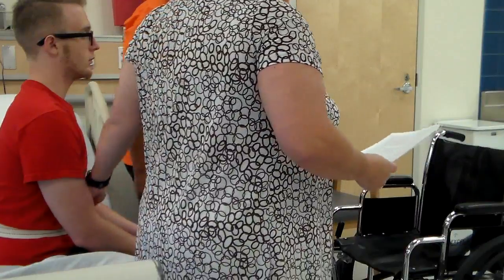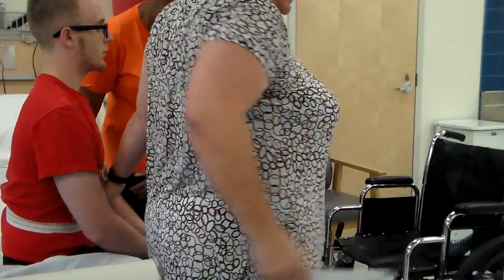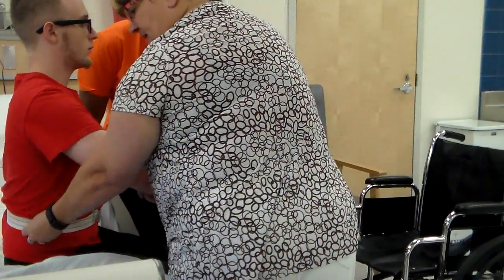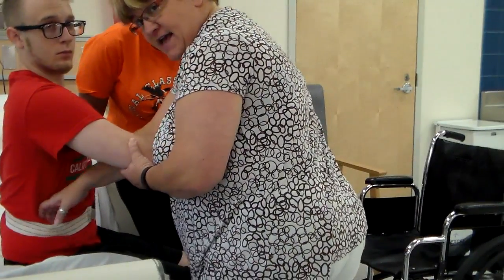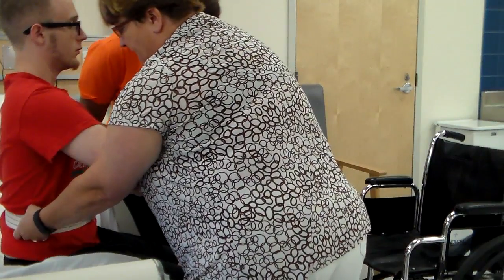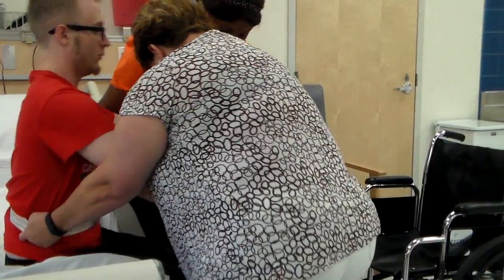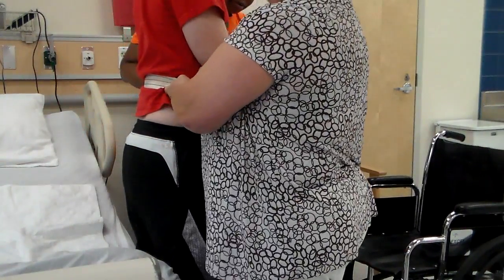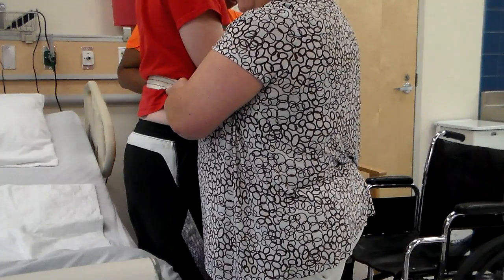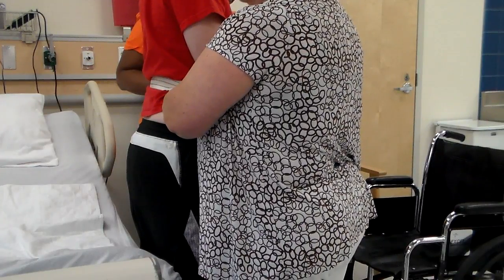You're going to grasp the client's transfer belt with the hands closest to the client, and the other hand supporting the client's elbow. So it's going to be looking like this, okay? You're not going to have it like this, okay? It's like this, okay? So then on the count of 3, we stand. 1, 2, 3. Okay. And as we stood them, one of us is going to have our feet in front of his feet because we don't want them going out, right? Right, exactly. So now we have them standing. We stand there for just a minute.